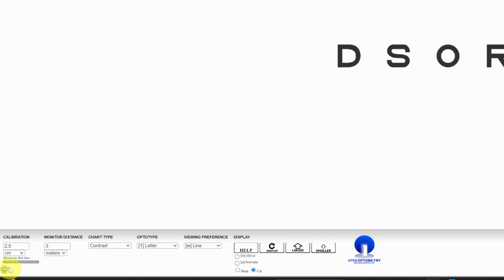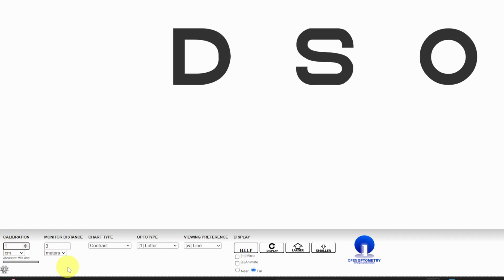And then the other thing is, once you've set this to 3 meters, you just measure this line. So the distance from there to there, and you input that value over there. And then it will make an adjustment. It knows the size of your monitor and how far the distance is, and you've measured the size of that line on your ruler on your screen, and then it will do an adjustment for you, and then it'll work. Obviously, if you're running this online, you have to be connected to the internet to do that.